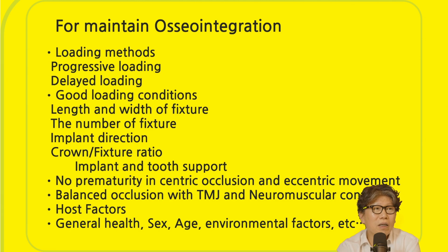If you look at the implants that are failing now, they're implants that have a lot of cantilevering because of poor positioning. These things tend to fall out. And nowadays, the fixtures that are just made to make it easier to implant, those are the ones that don't have good loading condition results. So I try to use as long and wide as possible, but the ones that are just threaded, the ones that are just pointed, are not good for longevity. It's not going to hold up from a longevity standpoint.